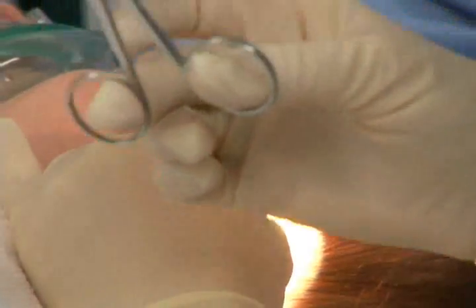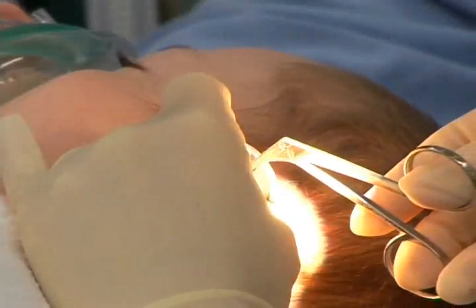Once the incision is made, the contents that are behind the eardrum need to be evacuated. We use a suction to do this. Once the contents are evacuated, we then are ready to place a tube. Usually we use something called a temporary tube. Temporary tubes just imply that the tube will stay in place approximately 9 months to 15 months.